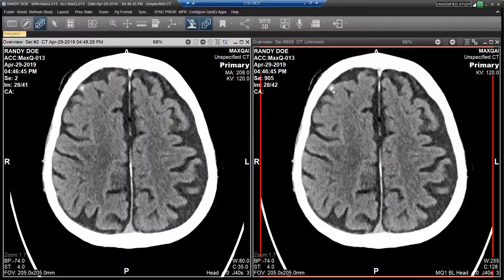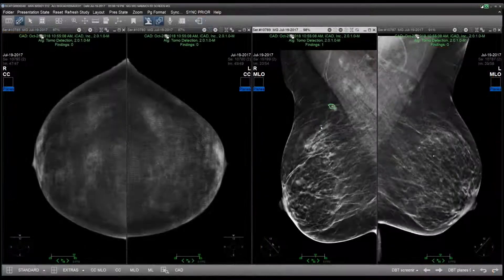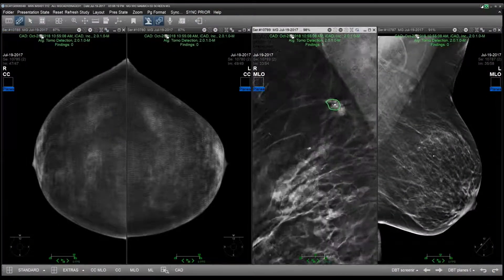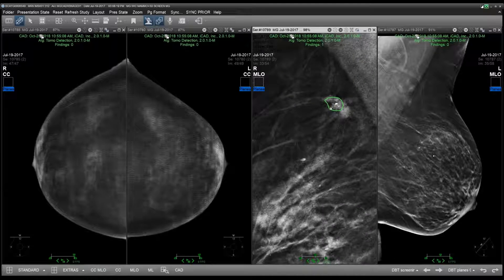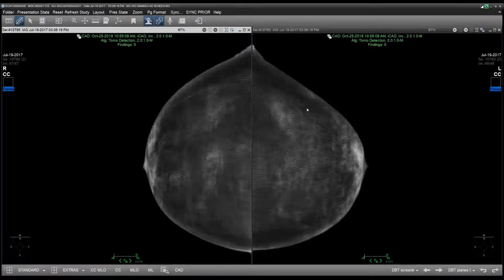This is important as subtle ICHs are sometimes very hard to see in non-contrast CT. The algorithm I am demonstrating here does not put a heat map or marker on the image around the suspected ICH, but other algorithms such as those for mammography lesion detection might provide a contour boundary and may even return biomeasurements for me.